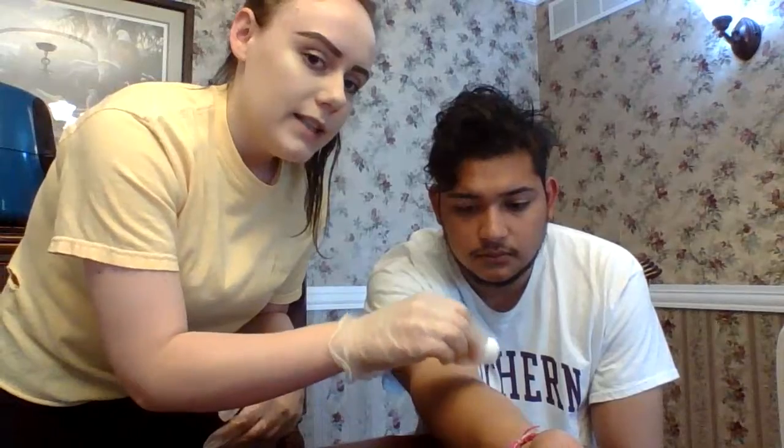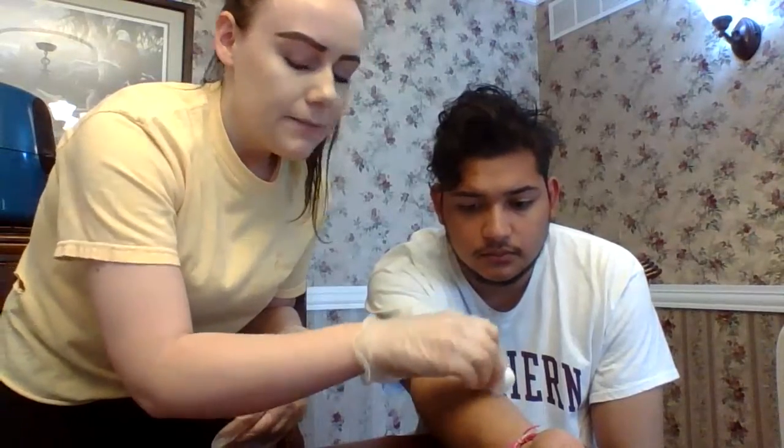I'm going to engage my safety, and I'm going to put this into the sharps container. I'm going to instruct my patient not to rub or massage or scratch the site. He says he won't. So I have my gauze here. I'm just going to lightly dab the area if there is any bleeding. Are you comfortable? Mm-hmm. He says he feels okay. So I'm going to go ahead and take off my gloves and foam.